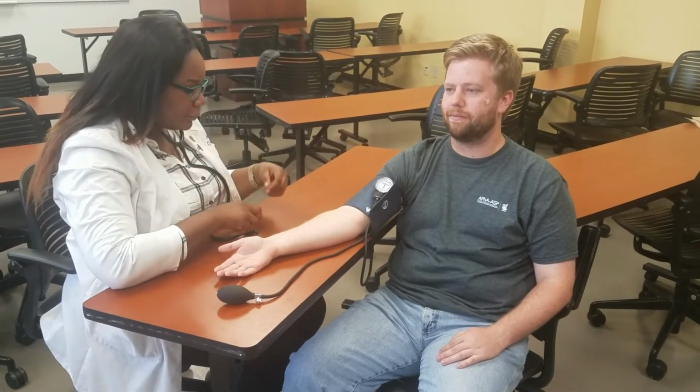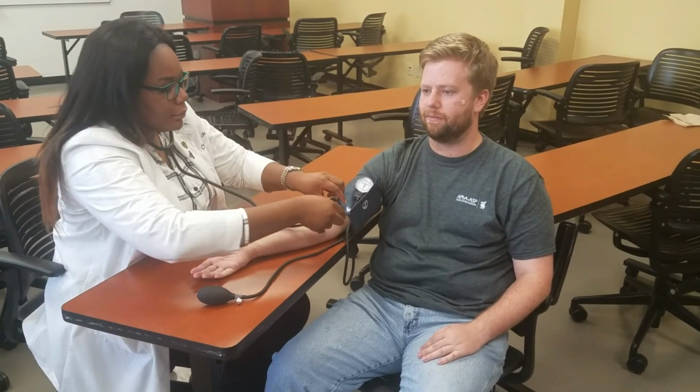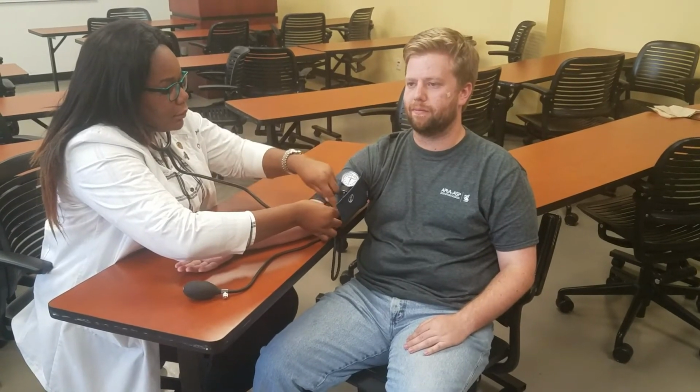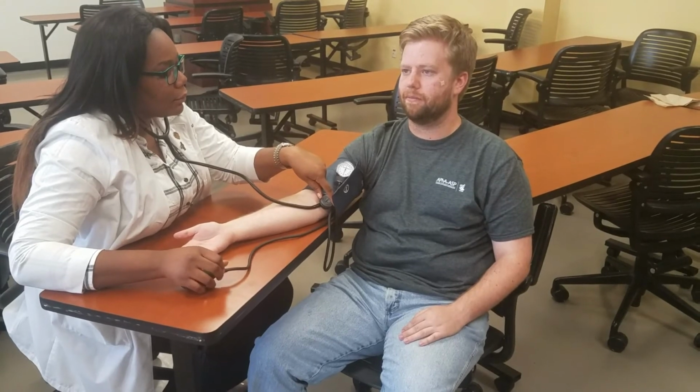At this point, the pharmacist will then ask the patient for the most recent blood pressure reading. Once the pharmacist has obtained the most recent blood pressure reading, she will then rapidly inflate the cuff to 30 millimeters of mercury above that systolic reading.